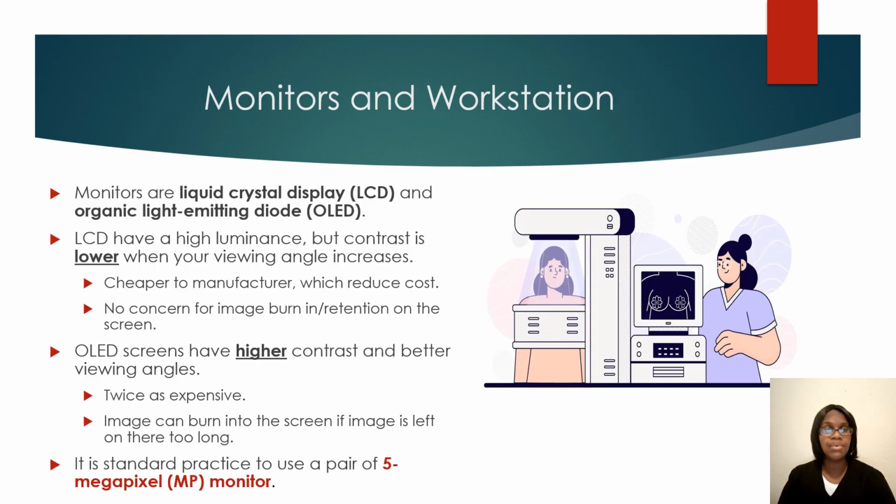The good thing about our workstation and monitors in mammography is once we get done taking the picture, we can see the image immediately on our screen if a patient moved or if they couldn't follow instructions well. Then we can see if we need to repeat the image versus having to go to a dark room and process it. And then you also have the radiologists who have their own monitors. They can see a lot better on their screens compared to ours.